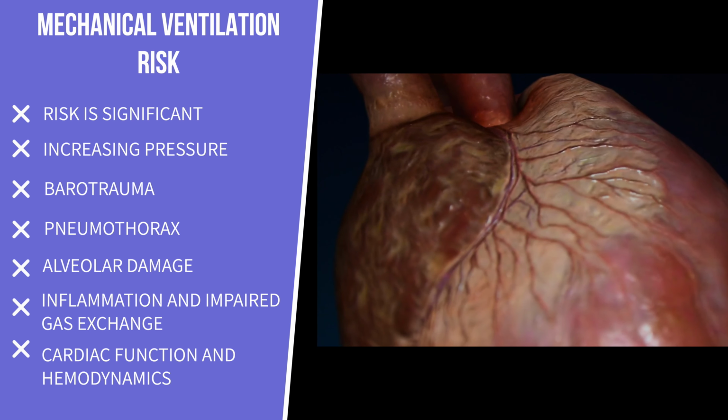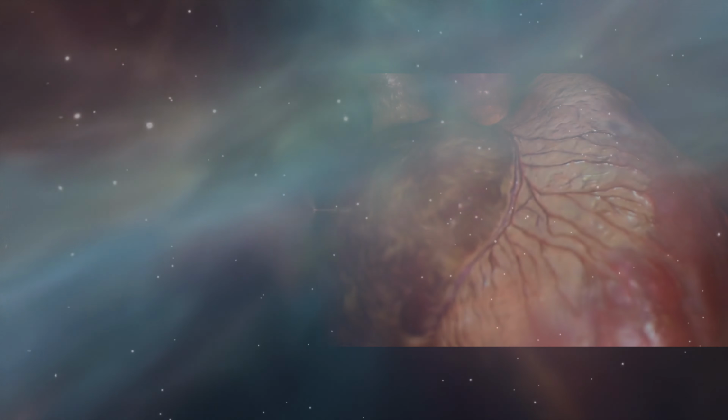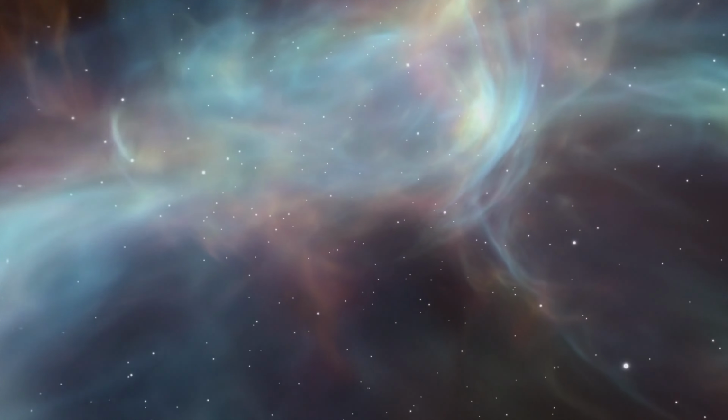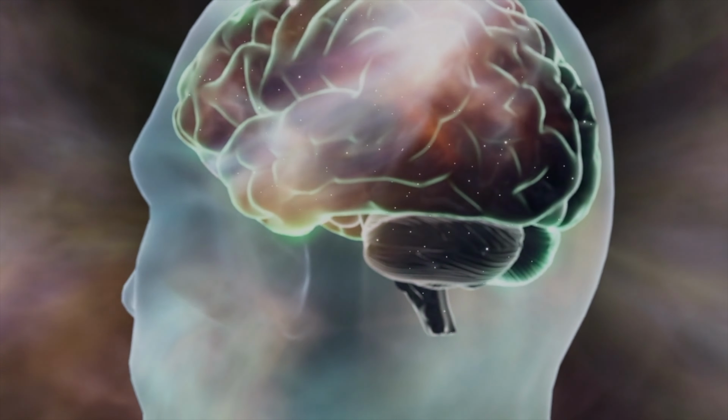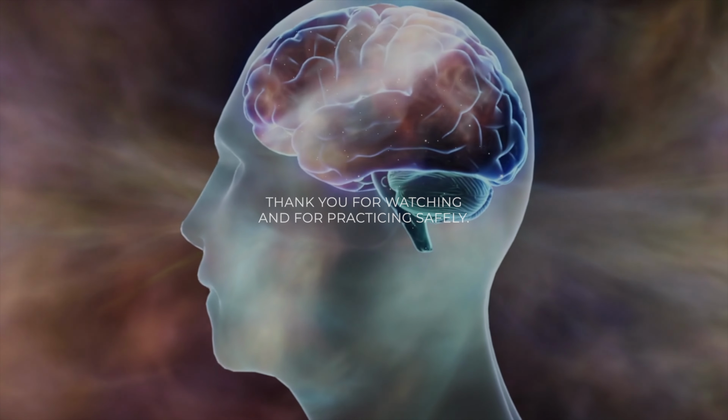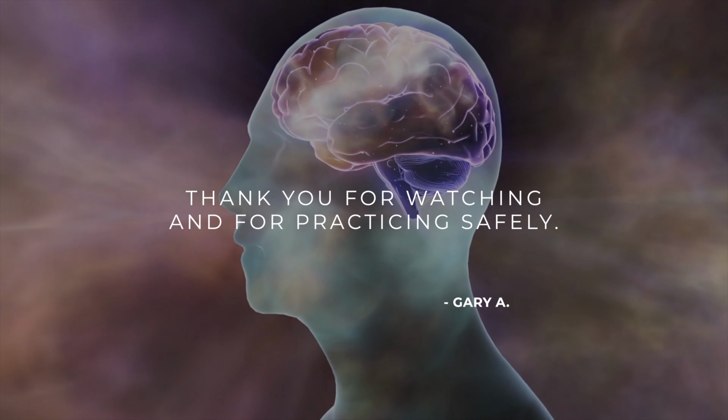Positive pressure ventilation can also affect cardiac function and hemodynamics, potentially leading to hypotension. Your awareness of these risks is crucial in providing safe and effective patient care, and understanding them will help you mitigate these risks in your practice.